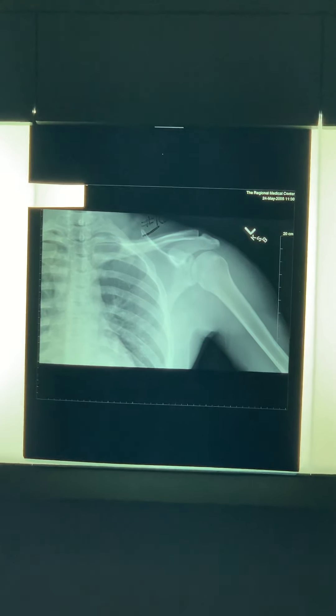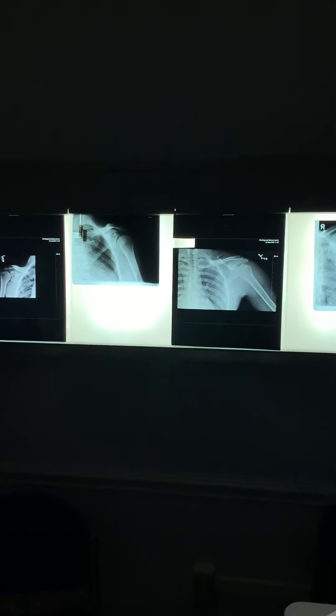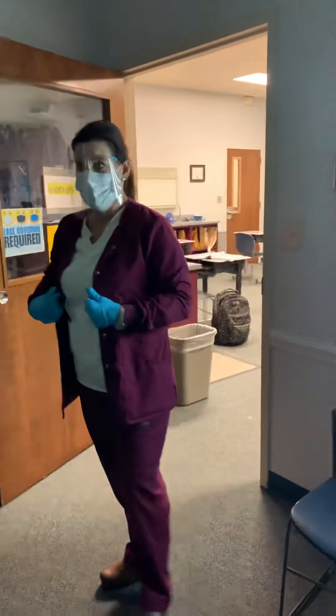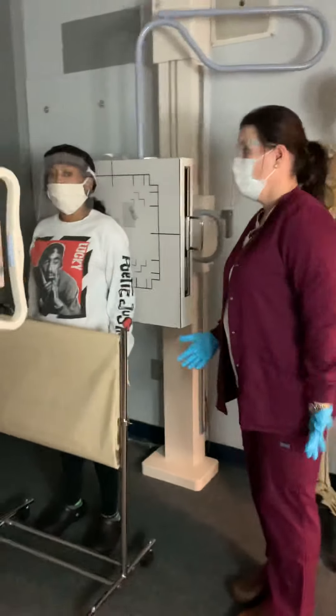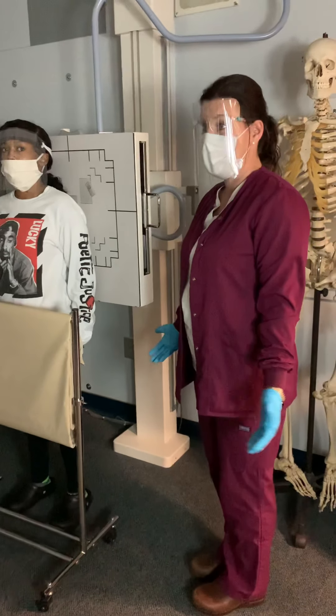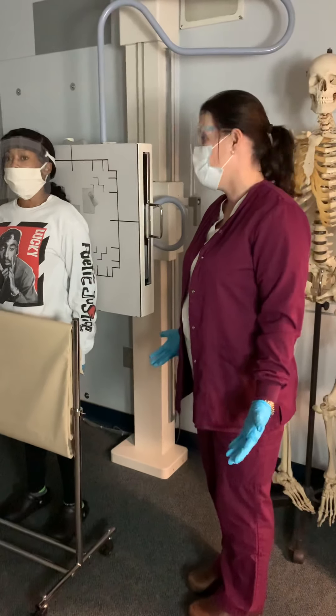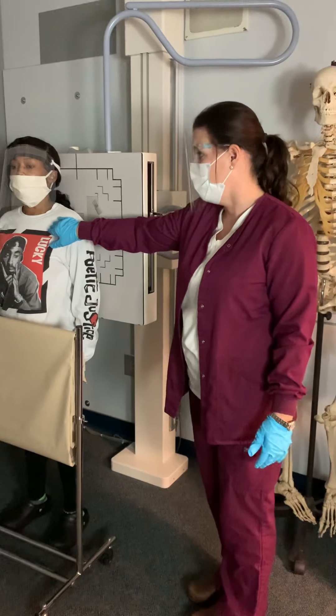The neutral is by the side — the greater tubercle is not necessarily in profile, it's just anterior. We do the neutral only if the patient comes in and is unable to move their arm at all — maybe there's a fracture you can see, or they're in so much pain they can't rotate. Then we just leave the arm by the side and shoot one inch below the coracoid.